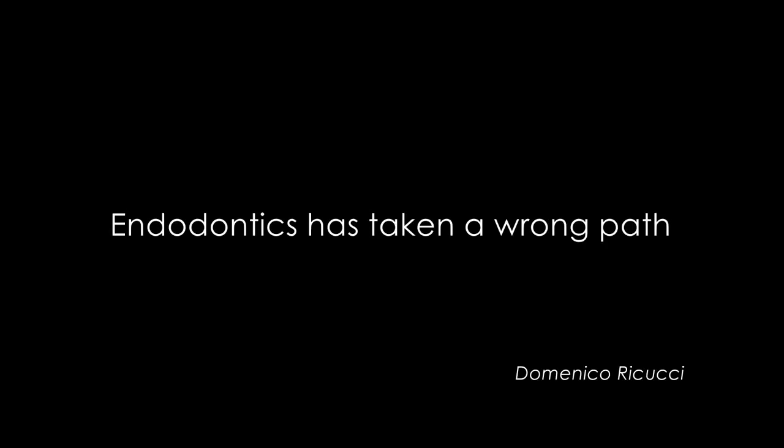Endodontics has taken a wrong path. There is a lot of confusion concerning the way to determine the working length using electronic apex locators. With this video showing the treatment of a simple routine case, I am insisting on the way to establish the correct working length at the apical constriction using electronic apex locators.